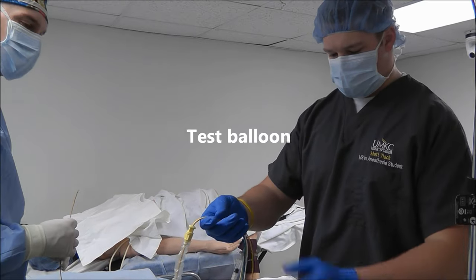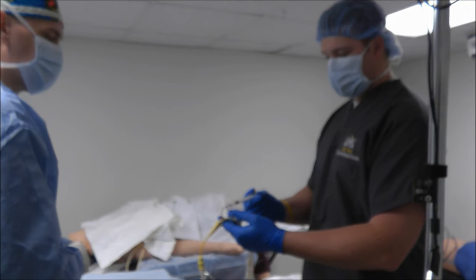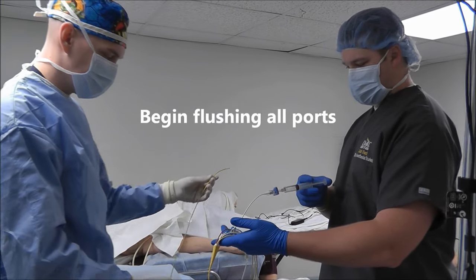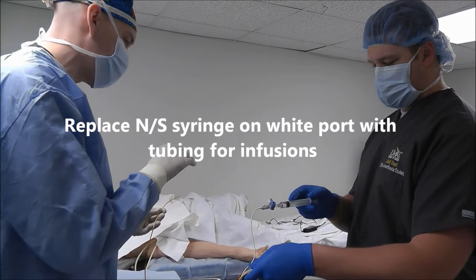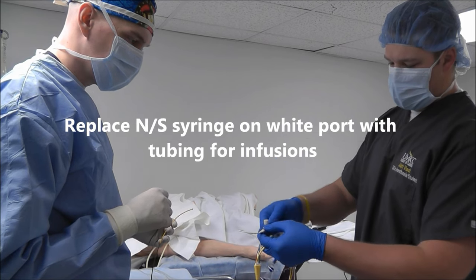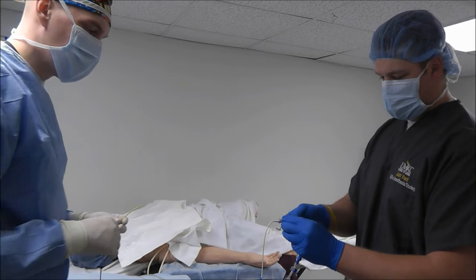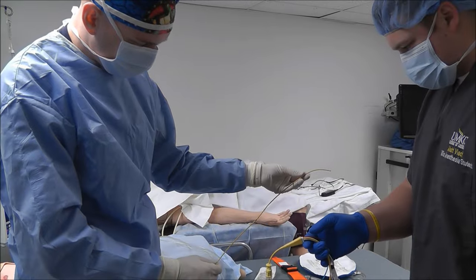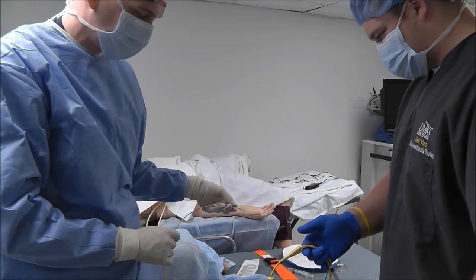Let's test the balloon. Balloon up. Balloon's good. Deflate the balloon. Go ahead and flush my white port please. I can see that it's flushed. Go ahead and hook up my infusions — my infusion tubing here to the stopcock. I'll open the stopcock. Now go ahead and flush my CVP please. Looks good. Go ahead and flush PA. Looks good. We're ready to float this thing.